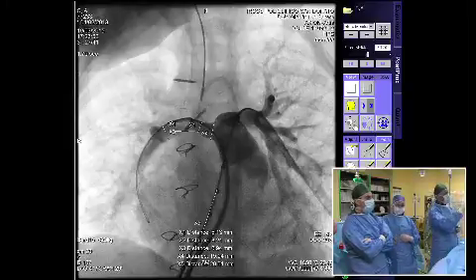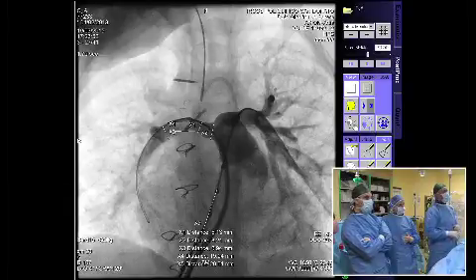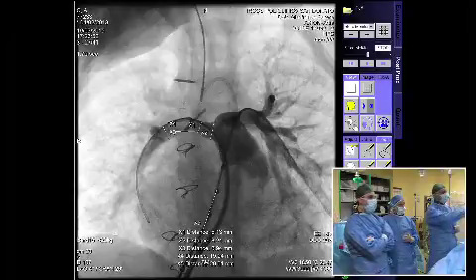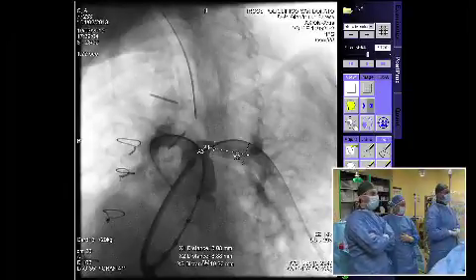If we go to the left, the other picture there, please. Miriam, may you show the next picture? Next picture, please. Next still frame. Here we are.